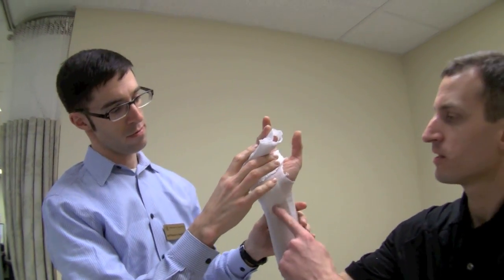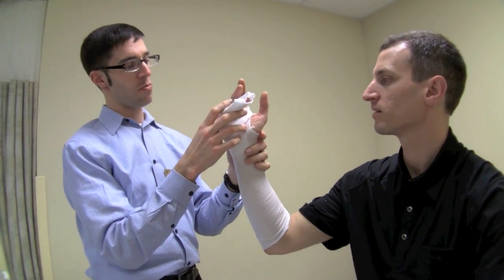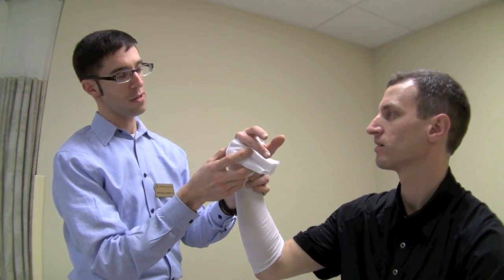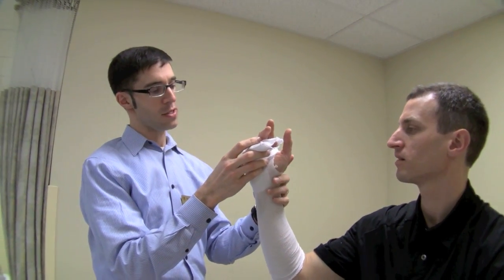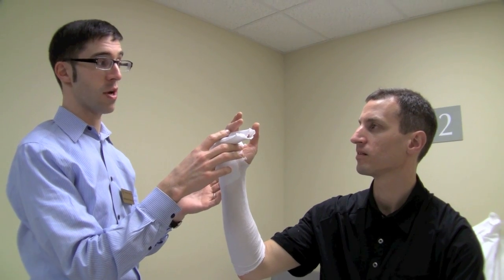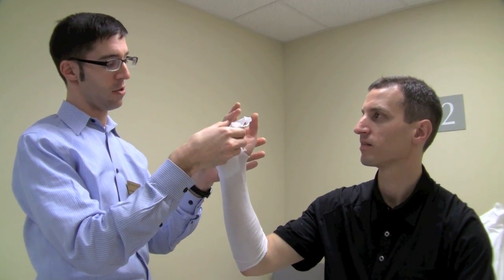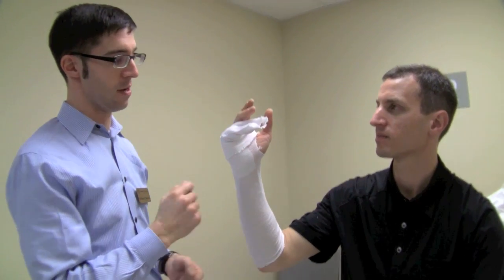Does it matter how much flexion or extension you have at the wrist? Just from a comfort standpoint, the more flexed it is, the less comfortable it's going to be. If you get your wrist into about 20 to 30 degrees of extension, that's normally going to be the most comfortable position and makes it easiest to get your fingers down, as it takes a little tension off the tendons.